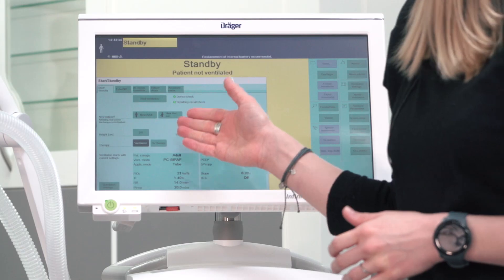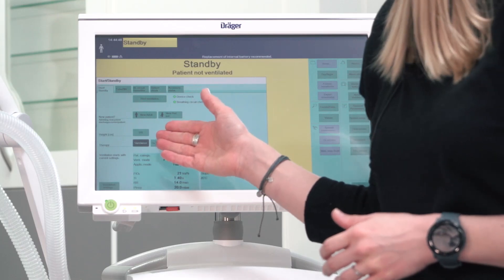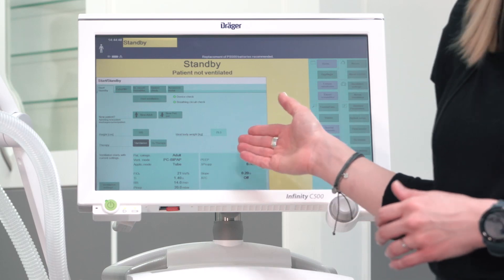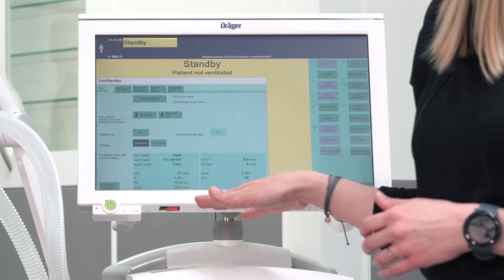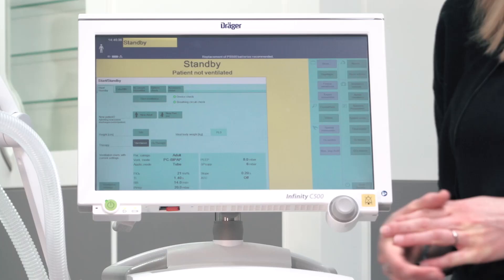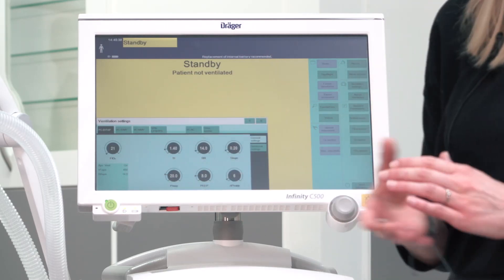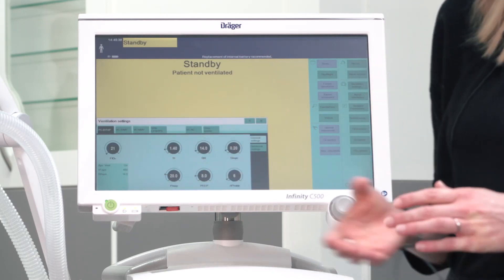In this scenario, we will ventilate an intubated patient. Start by entering the height; subsequently, the ideal body weight is calculated and will adapt the ventilation settings of your default ventilation mode. If you want to adapt these settings, please enter ventilation settings, where you will find the related parameters and further ventilation modes.